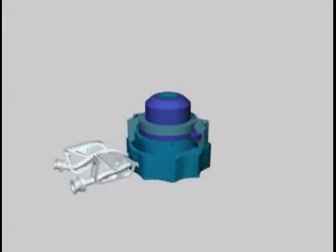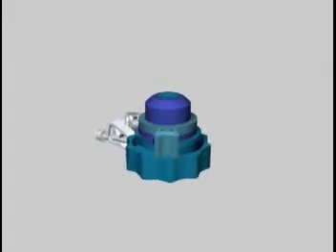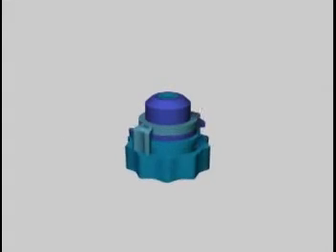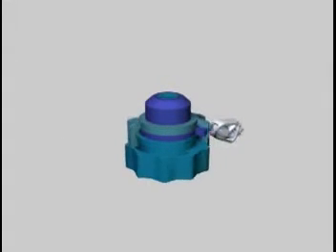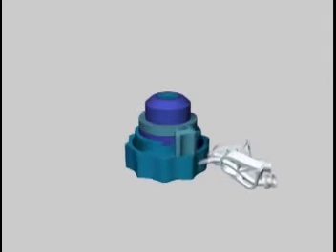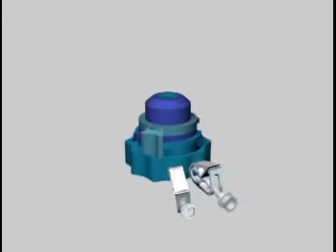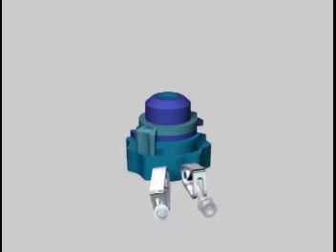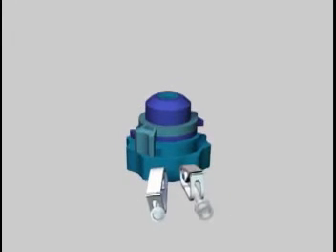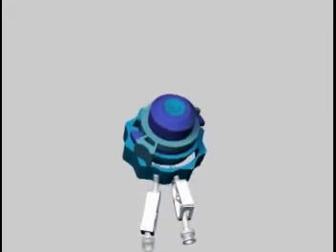The device is designed primarily to be used as a companion to the popular Barron Vacuum Trephine to allow for donor buttons to be cut with the epithelial side up, as one currently does for the recipient cornea.